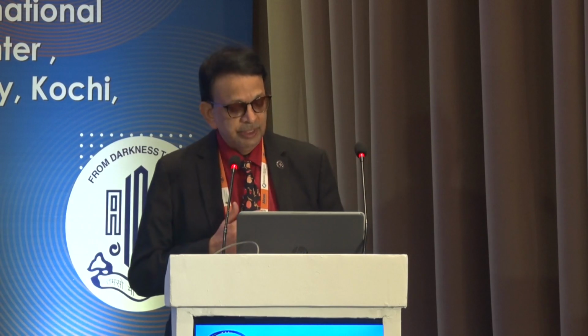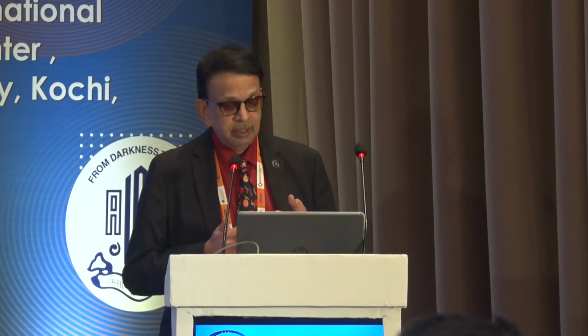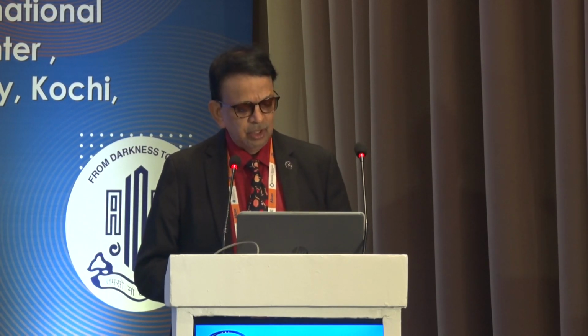Like doing the incision, you can do the incision main port, side port, unless you have a dense arcus in the limbus. You can do the LRI, which is actually very predictable. Less than one diopter, I do the LRIs. Perfect rhexis, nucleus liquefaction. You can work in complex situations like white cataract, brown black cataract, subluxated cataract, and all these things. So the fragmentation settings, I think it's beyond the scope of the lecture.